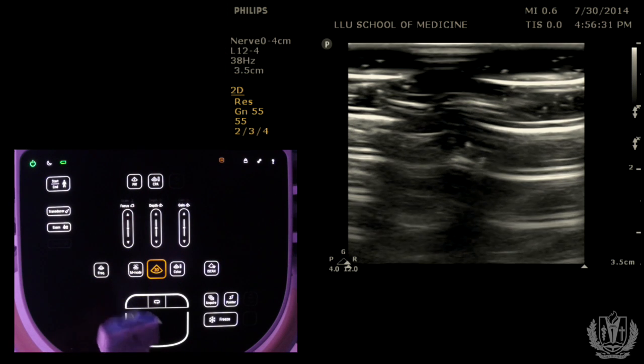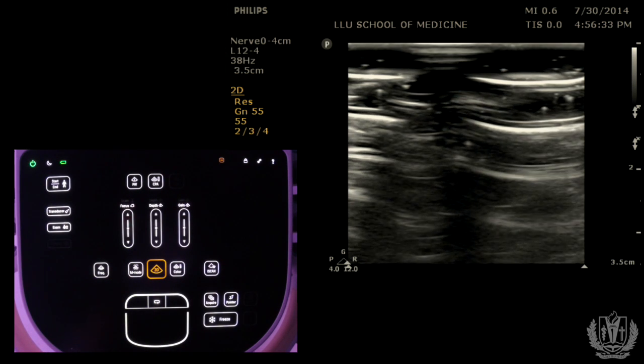The 12-4 corresponds to the frequency of the probe. The higher the frequency of the probe, the more superficial structures you can scan. The lower the frequency, the better the penetration, but the lower the resolution. So pick the appropriate probe for your application.